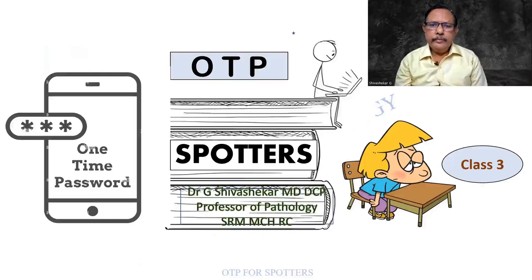Now, dear students, we shall be going on to class 3 of OTP, one-time password for spotters. We shall and will remember this. And please superimpose the slide or the specimen onto the slide or specimen you have got in your institute.